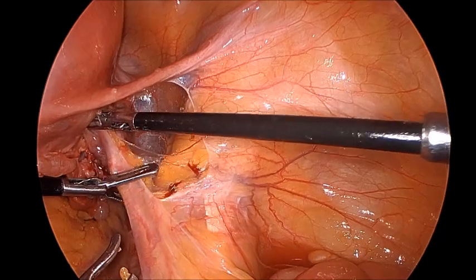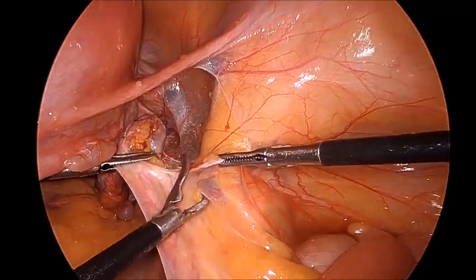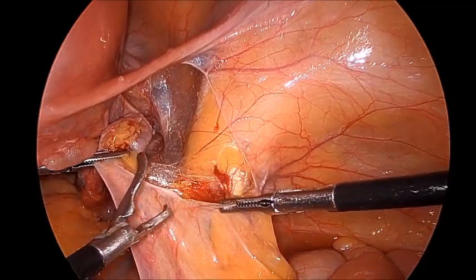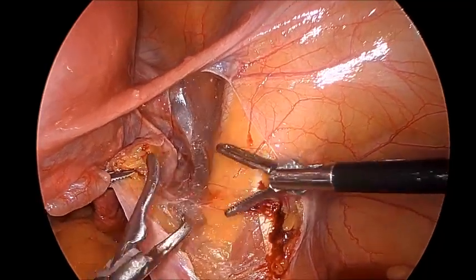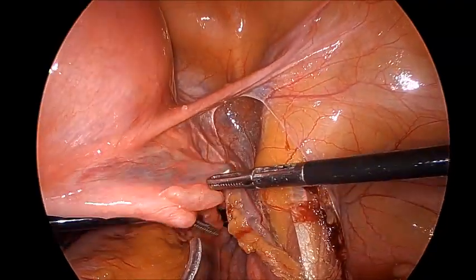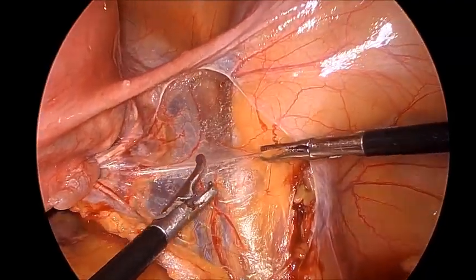Certain tissues are cut using the bipolar. What we see here is we are slowly dissecting into the space to identify the structures within this space, that is the ureter and the internal iliac artery, mainly the anterior division of the internal iliac artery and the uterine artery at its origin.